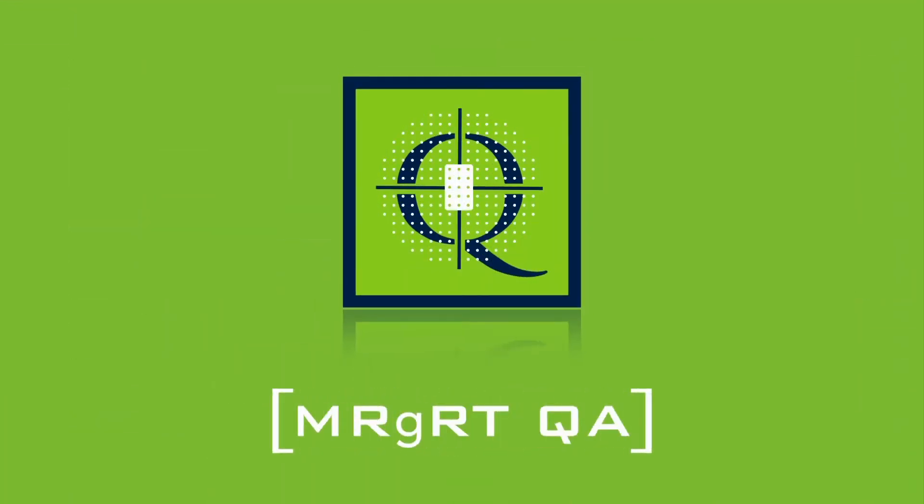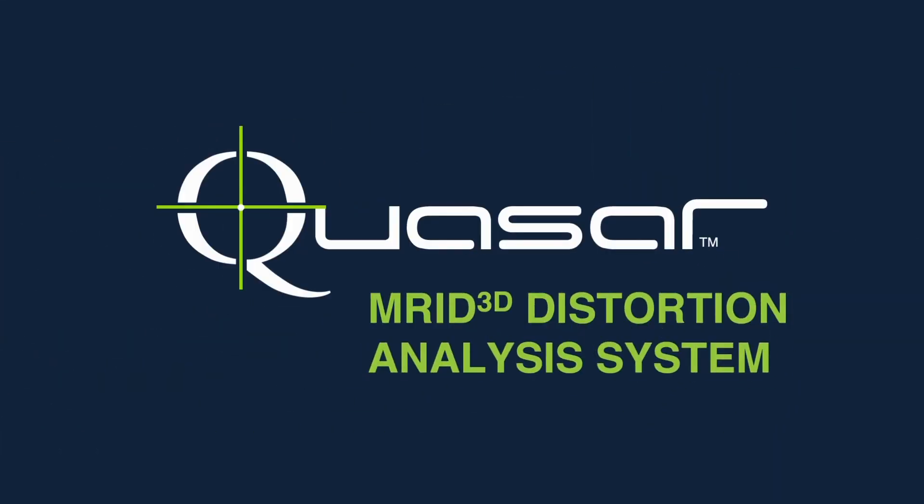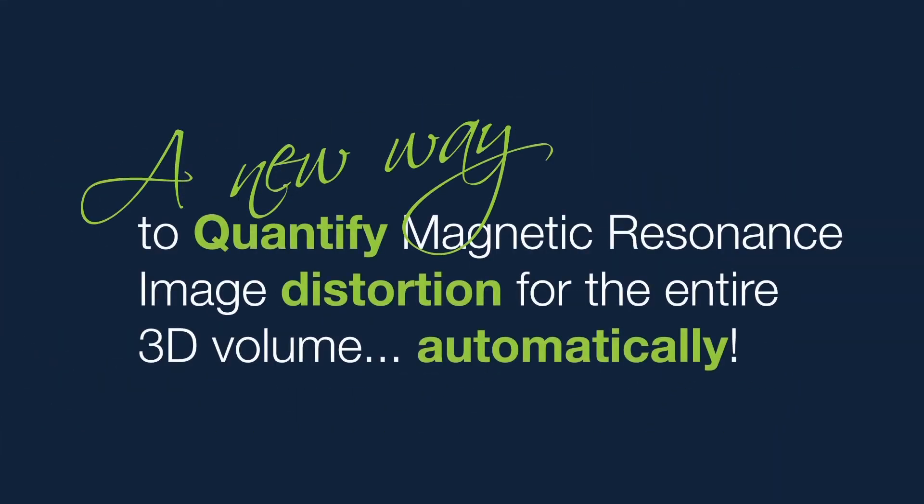The Quasar Amoride 3D Geometric Distortion Analysis System from MODIS-QA is a new way to quantify magnetic resonance imaging distortion for the entire 3D volume, automatically.